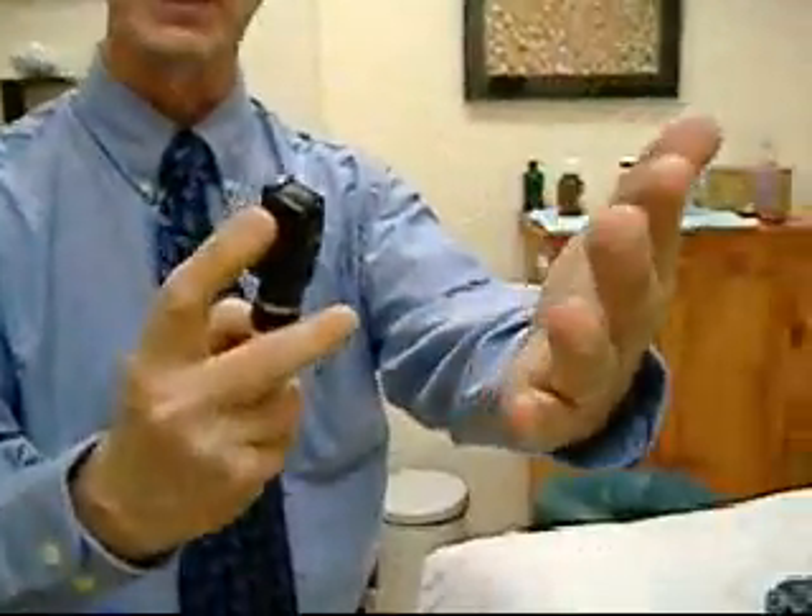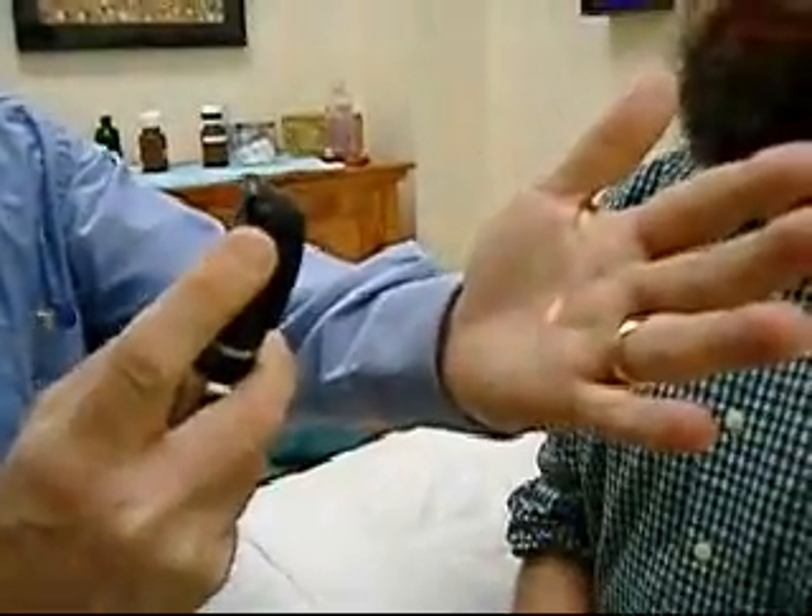Hi, I'm Michael Redmond and we're going to look at how to use the ophthalmoscope, a device for looking in the eye. The ophthalmoscope has a focus dial and you want your finger on that. You want to turn on the ophthalmoscope, because otherwise you can't see anything, and you would shine it against your hand to make sure it's on.